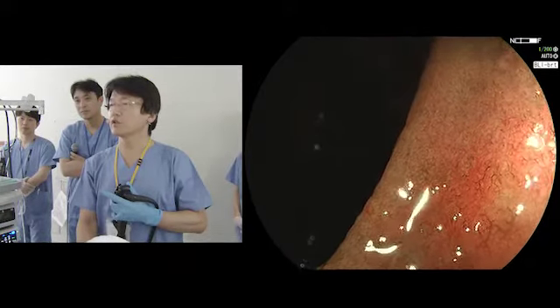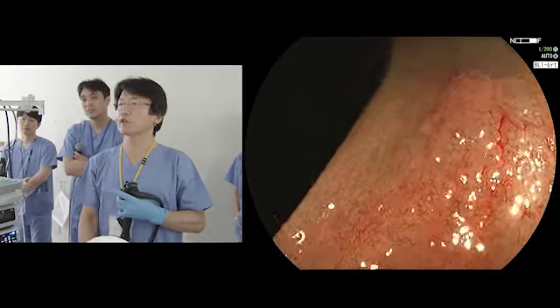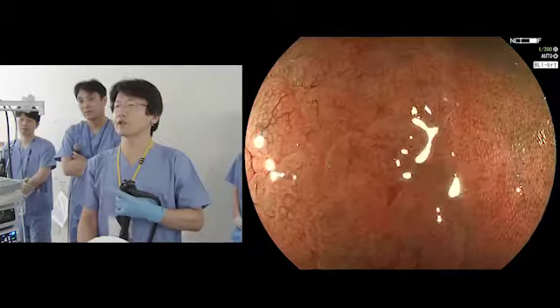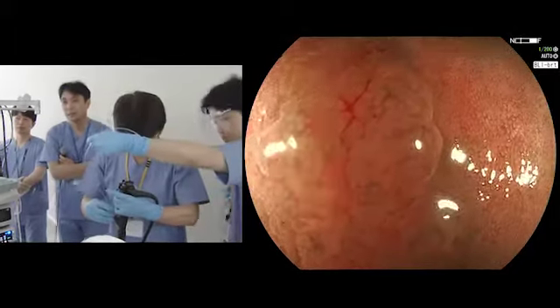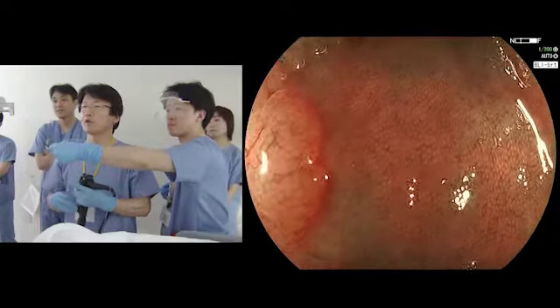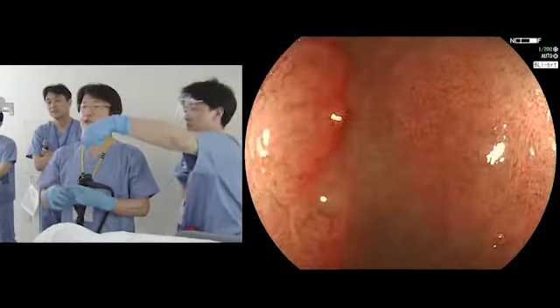So usually we don't put markings for colorectal lesions for ESD, but this lesion is very unclear, so I will place markings. I use a Flush knife BT tip, 1.5 millimeter length.